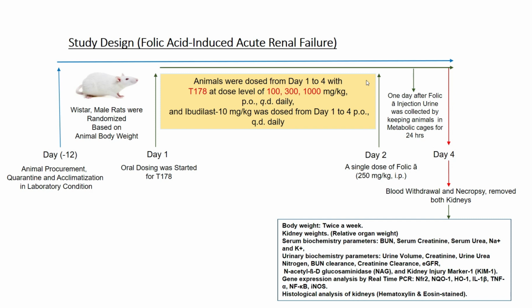In standardization of the model we have to see that sometimes the disease recovers after 7 days. In that condition we have to terminate this experiment in 2 days. So while we are inducing, we have to check the blood parameters after 24 hours or after 2 days. After 2 days we will check serum creatinine and serum urea.